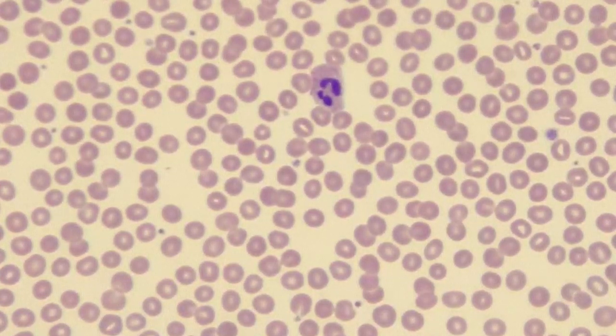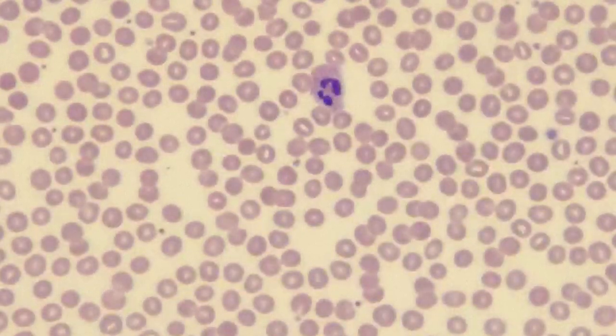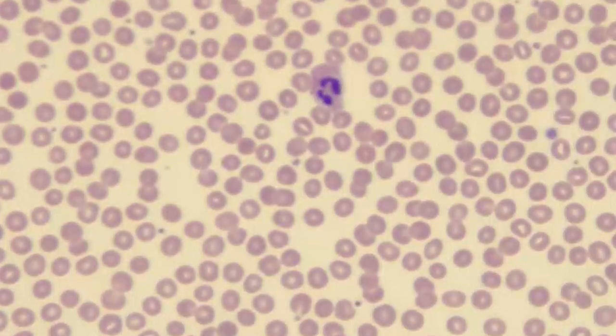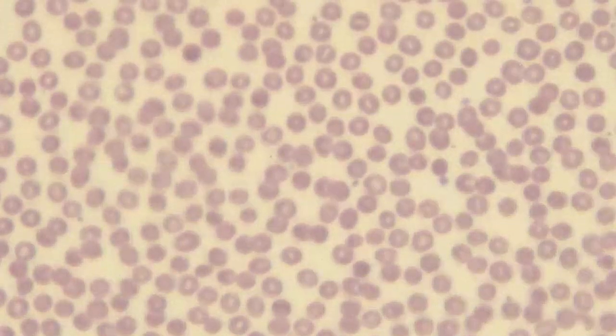They should have a central pallor if they're normal, and on the hematology analyzer printout for this particular patient, everything was normal. So I expect, when I put the slide on the microscope, that we're going to be seeing normal red blood cell morphology, and that looks to be the case. And it does look like these cells have stained properly.